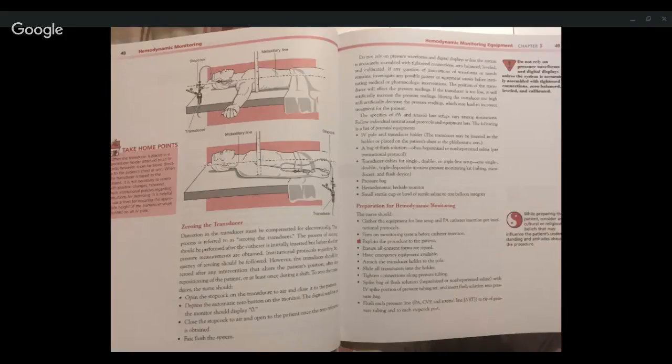To zero the transducer, you should open the stopcock on the transducer to air and close it to the patient. Depress the automatic zero button on the monitor. The digital readouts on the monitor should display zero. Close the stopcock to air and open to the patient once the zero reference is obtained. Fast flush the system.